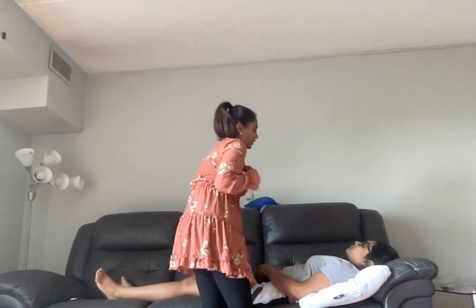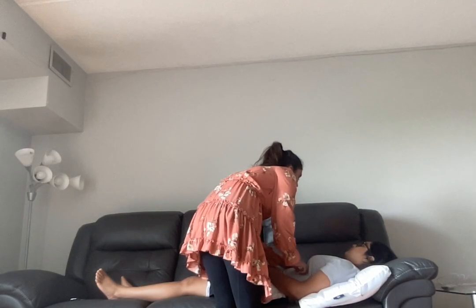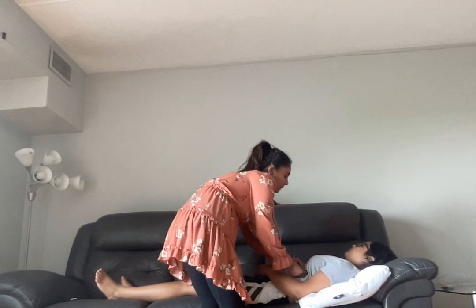I am going to also palpate for the point of maximal impulse, which is about 1 to 2 centimeters in diameter. And now I am going to auscultate the anterior chest wall in all the 5 spaces. First is the aortic area, on the second intercostal space at the right sternal border, and now the left second intercostal space, left sternal border, would be the pulmonic area. And then Erb's point in the third intercostal space on the left sternal border. And now it will be the tricuspid valve in the fourth intercostal space. And now I'm going to have you lift your breast in the fifth intercostal space for the mitral area.